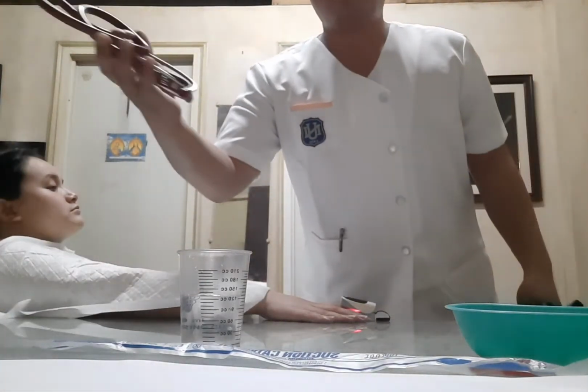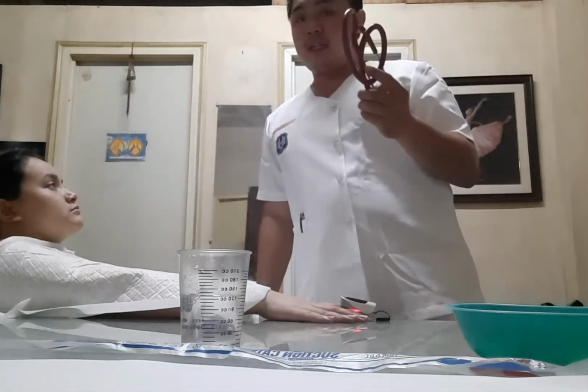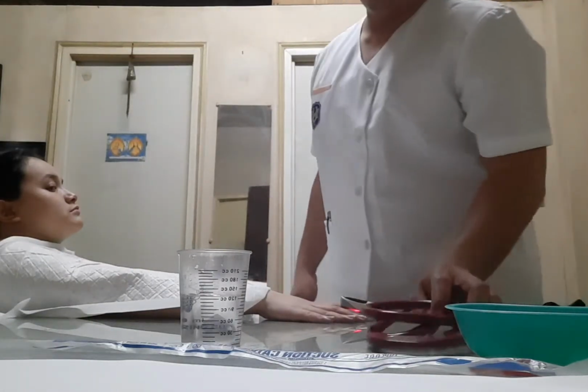And the stethoscope I will set aside because assuming that I already heard the lung sound of the patient, and as per the physician's order, it is already cleared and ready to suction.